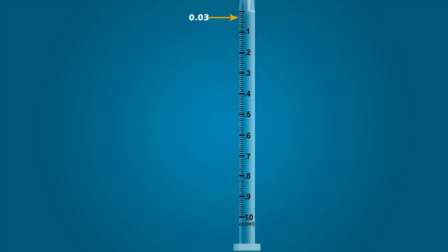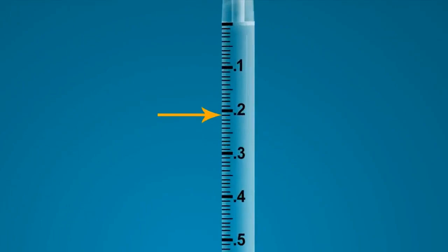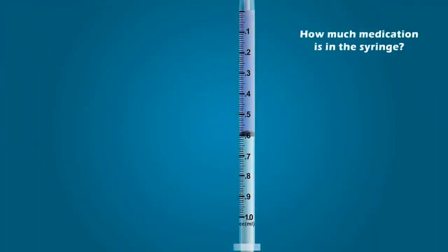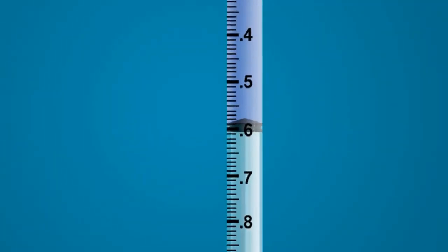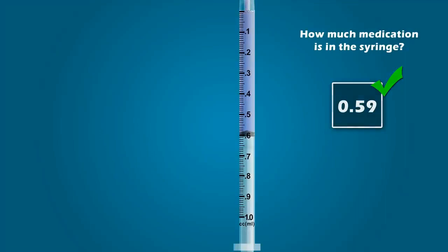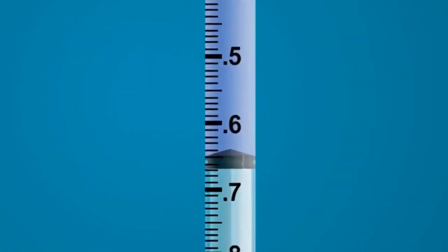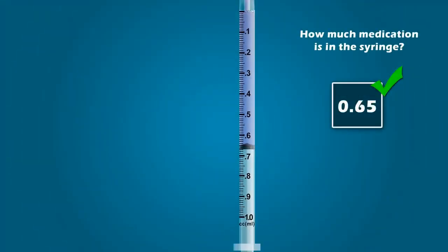Let's jump ahead so you can get a better idea of how the marks increase throughout the syringe. Here is 0.09, here is 0.1 — or you can also look at this as 0.10, because after 0.10 is 0.11, 0.12, and so on. So what is the value of this line? If you stated 0.21, you are correct. Now that you know the value of all the graduation marks, let's determine the amount of medication in the syringe. How much medication is in this syringe? If you stated 0.59 milliliters, you are correct. If you stated 0.65 milliliters, you are correct. Great job.